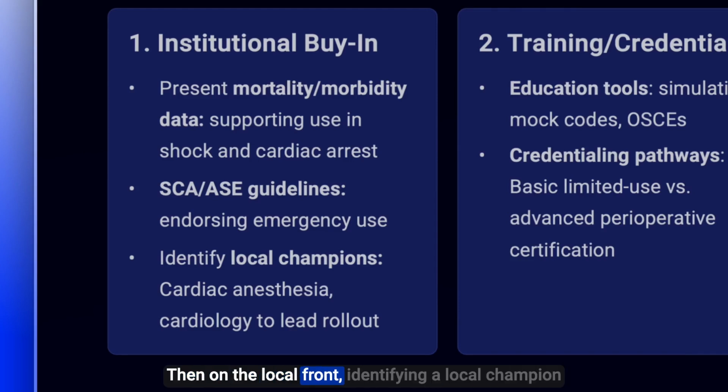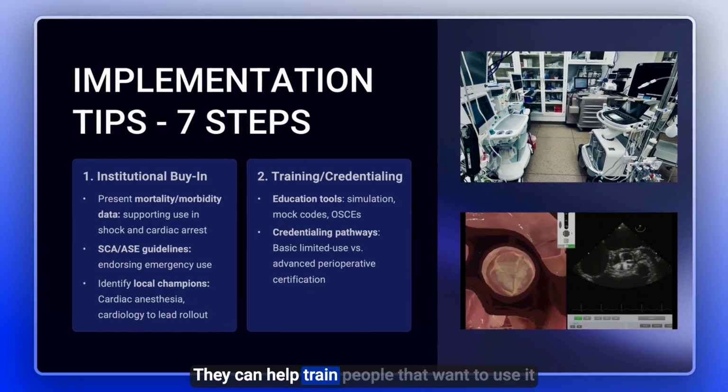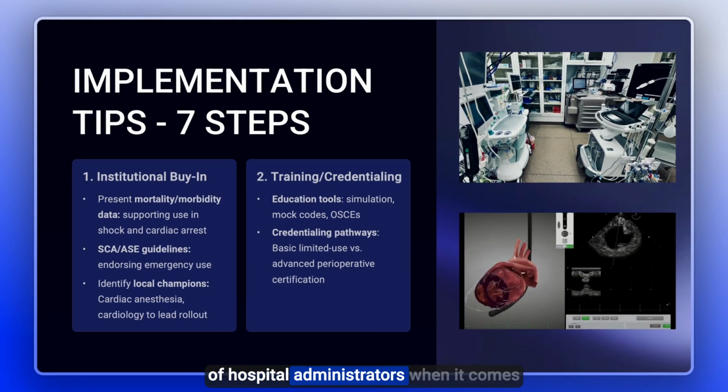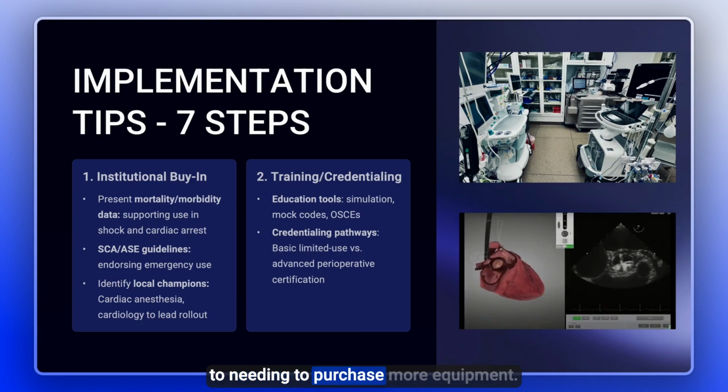And then on the local front, identifying a local champion such as a cardiac anesthesiologist or cardiologist that is TEE certified and can help lead a rollout in this area can be immensely helpful as well. They can help train people that want to use it more and more, and also advocate on behalf of hospital administrators when it comes to needing to purchase more equipment.